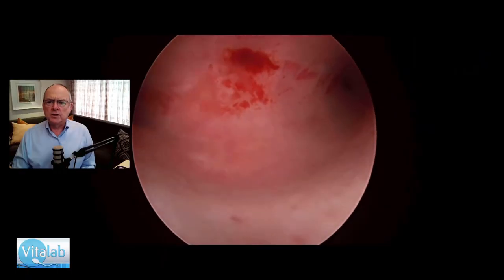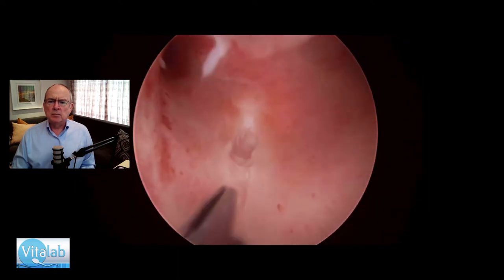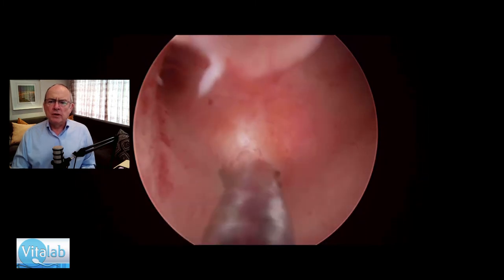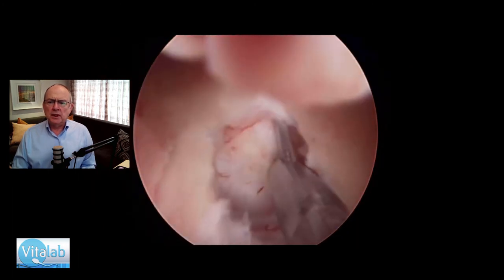If you watch carefully, you'll see as I reduce the pressure — watch the bulge here — there we go. There's the bulge. Now I open the endometrium over the fibroid using my scissors, to avoid catching the endometrium in my TruClear.